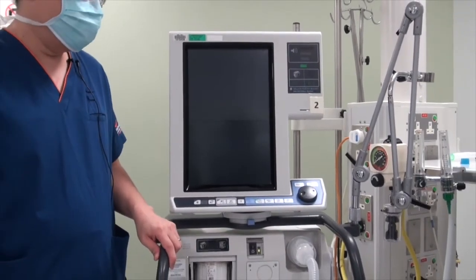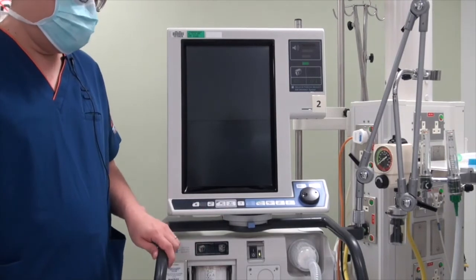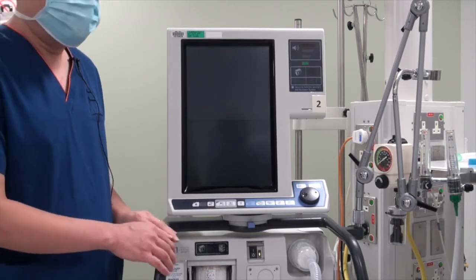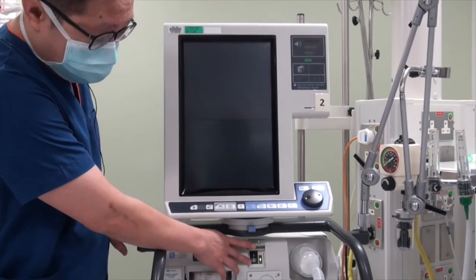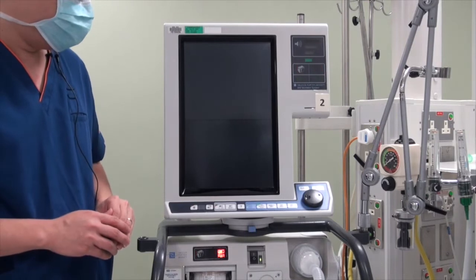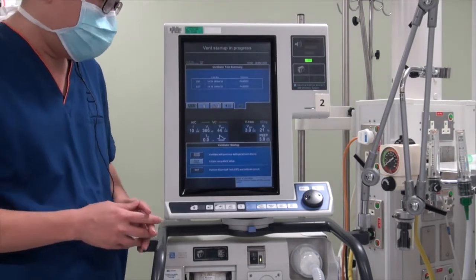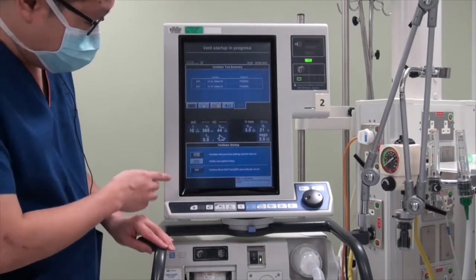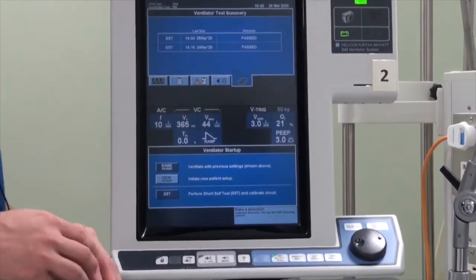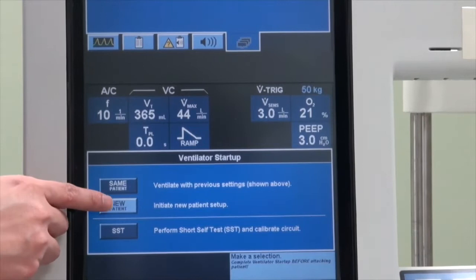Just to note that for the PB840, before we start the patient on mechanical ventilation, we need to make sure that the circuit is not connected to the patient before we switch the ventilator on. The power switch is actually located at the center of the unit. There will be a short welcome screen as the ventilator boots up. At the beginning, you will notice that there will be three buttons for you to select. We have already done the SST, so assuming this is a new patient, we just press 'new patient.'